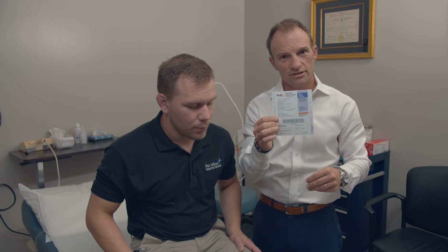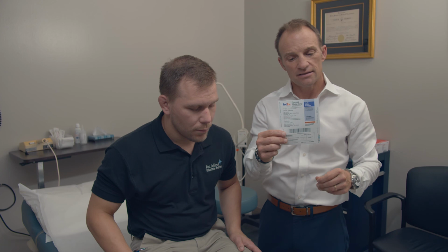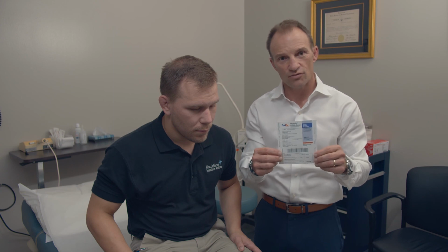You're going to have a pre-printed FedEx label. This will be affixed to either container that you have. Now remember, you have to either call FedEx to schedule a pickup or you have to bring it to a FedEx location. And it is somewhat time sensitive. It should be done the same day as collection. The cold pack will typically last 24 hours.